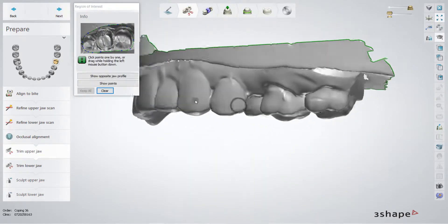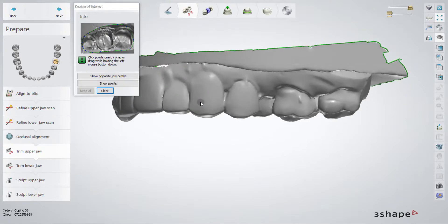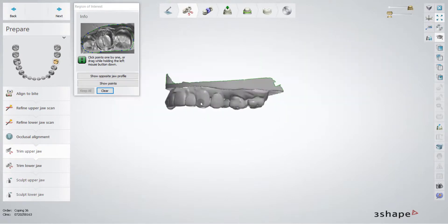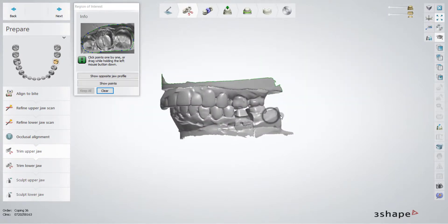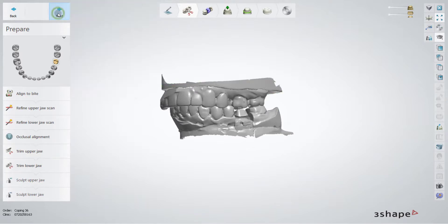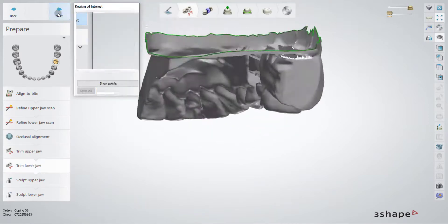In this part, we can trim the upper jaw if it is necessary. I really don't think it's necessary for this case.